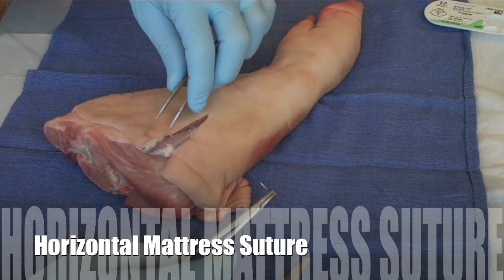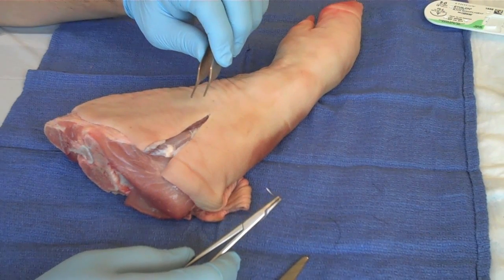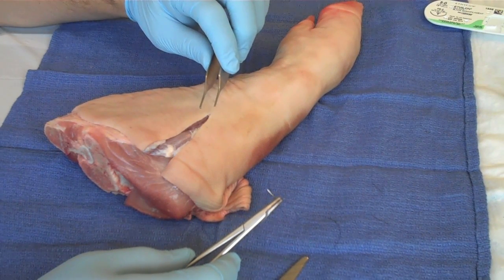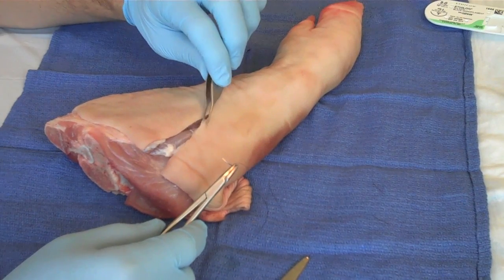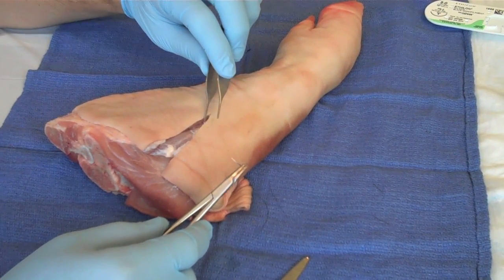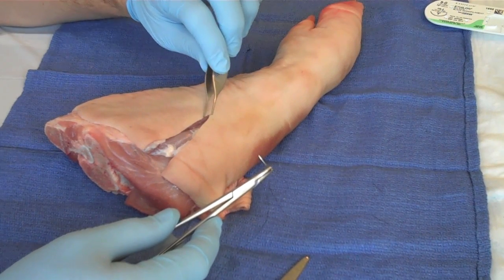We're going to do the horizontal mattress stitch. The benefit of the horizontal mattress stitch is that it gives you extra suture so that you can bring your edges together with less tension on any given point, because tension is what breaks down wounds and what causes wound dehiscence, which is not desirable.